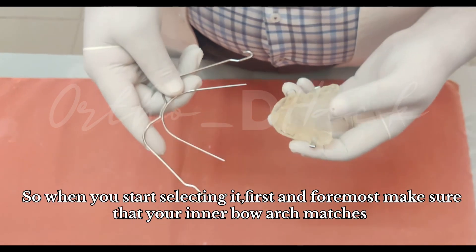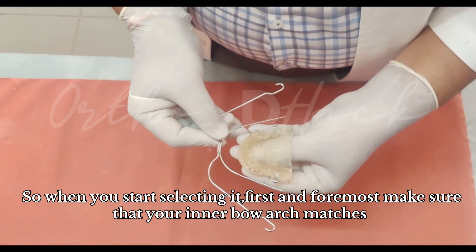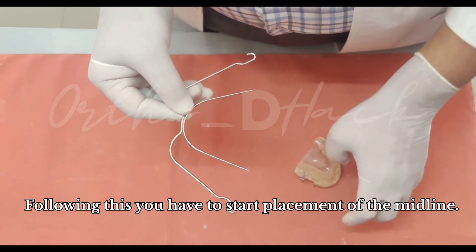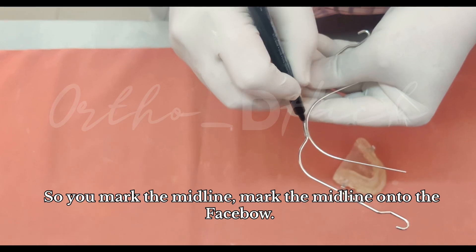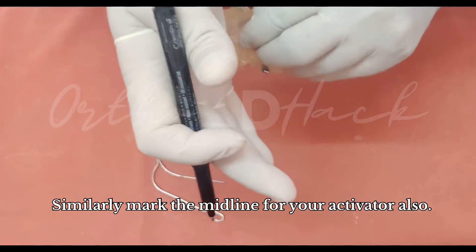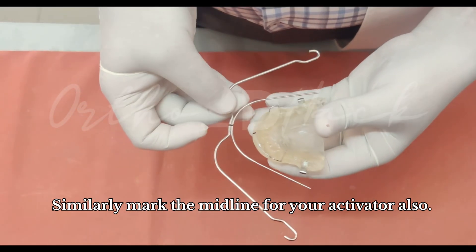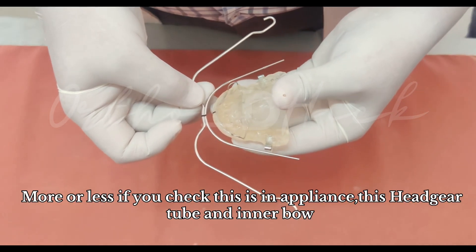When you start selecting it, first and foremost make sure that your inner bow arch matches with the contour of your activator — more or less it is matching here in this case. Following this, you have to start placement of the midline. Mark the midline onto the face bow, and similarly mark the midline for your activator, and try to coordinate them.